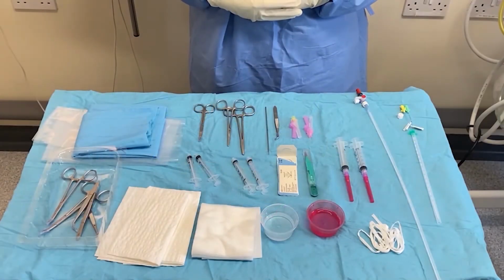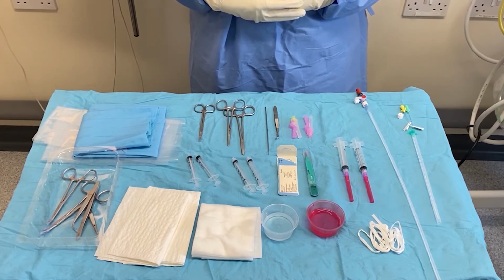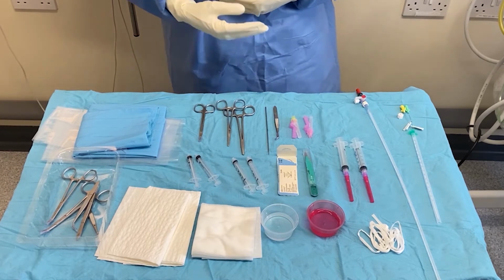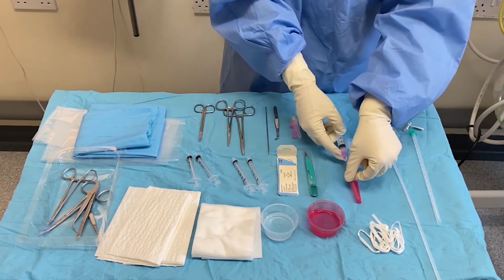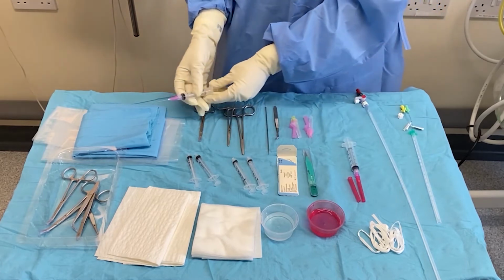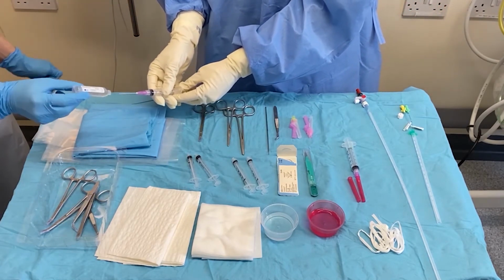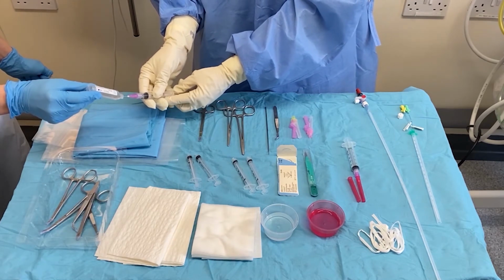So now I've got all of the equipment ready on the sterile field. I've got my sterile gown on and I've double gloved with 2 lots of sterile gloves. So now it's time to prime both of the lines with normal saline. So got our filter needle and our syringe, and with the help of my assistant with 0.9% normal saline, we'll draw this up.